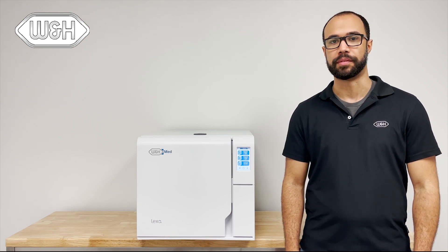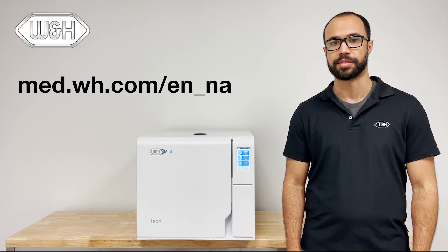This completes the installation of the Lexa sterilizer. For more information, please visit our website.